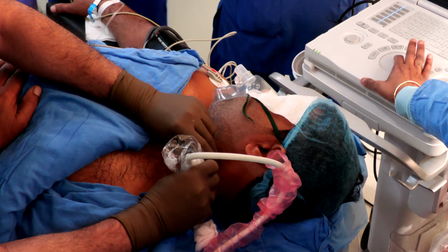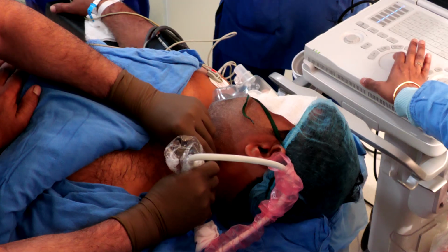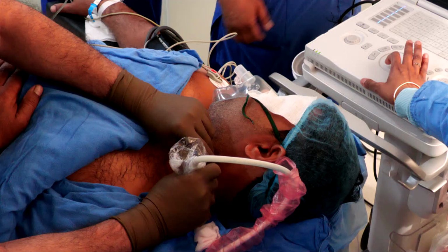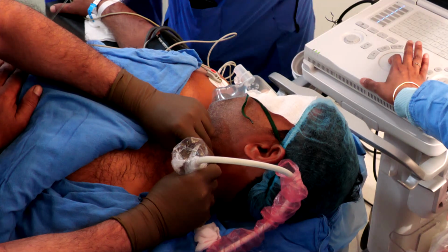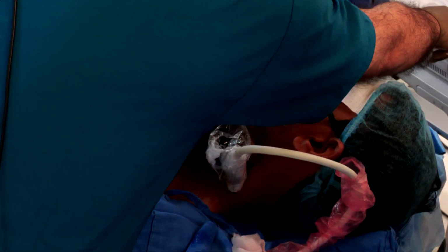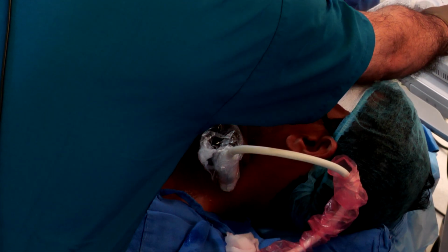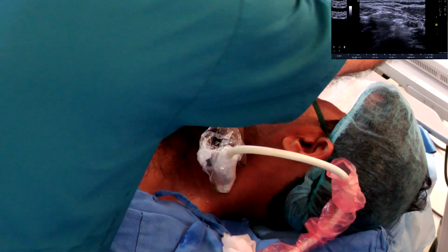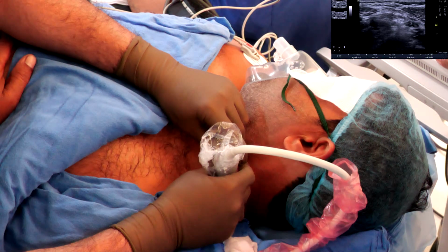And I'm now going to shift the probe a bit more caudal. You will see some hypoechoic shadows in the investing layer of deep cervical fascia. So this entire layer is the investing layer of deep cervical fascia. Just follow some hypoechoic shadows as they emerge and they move into the subcutaneous tissue.